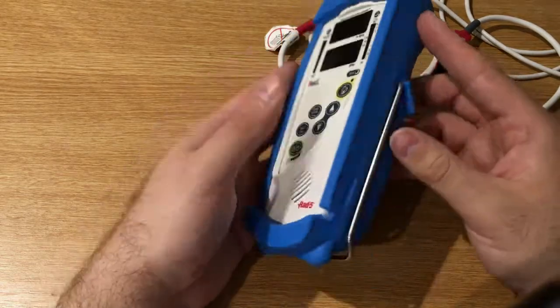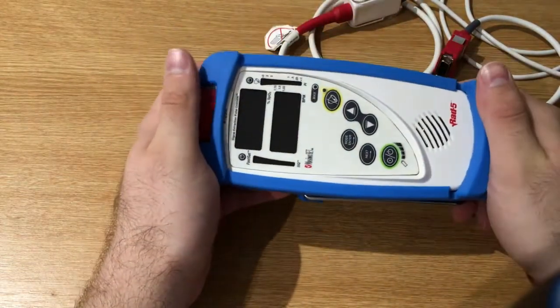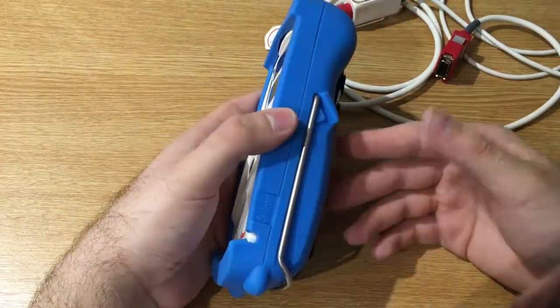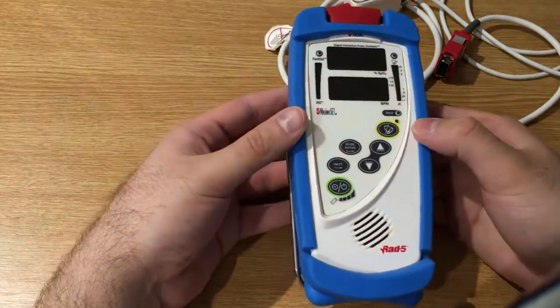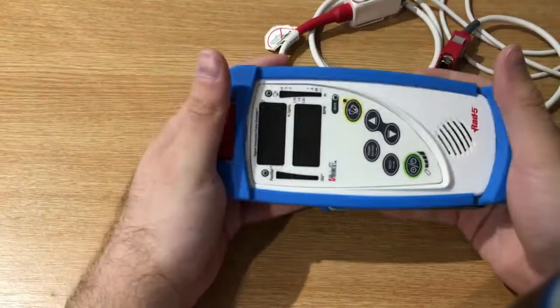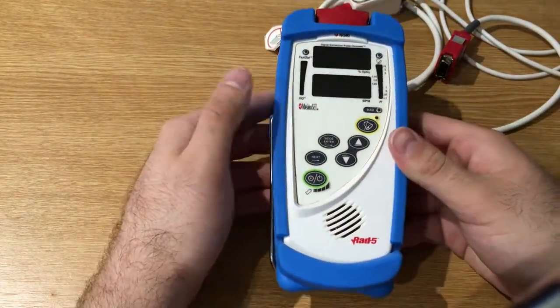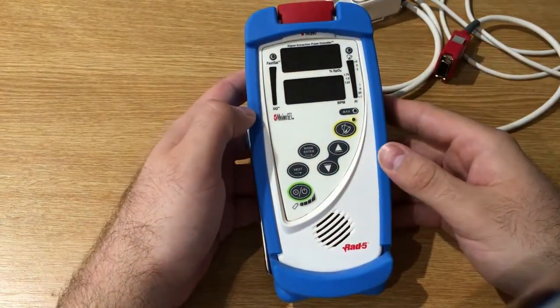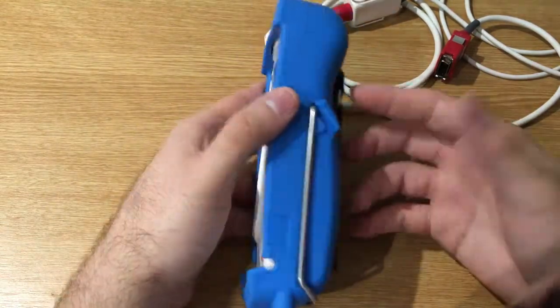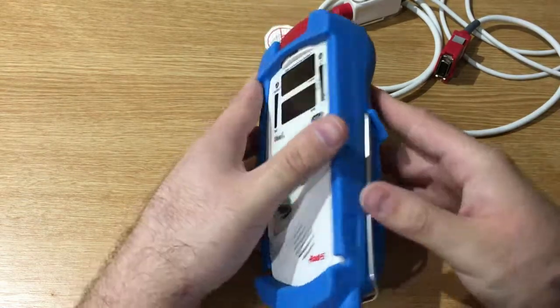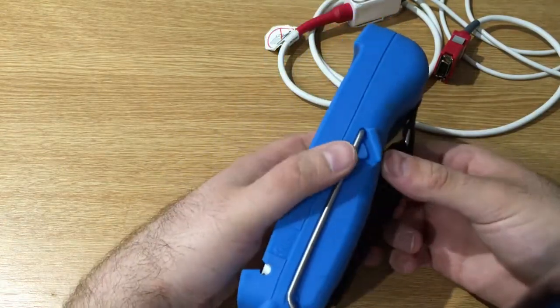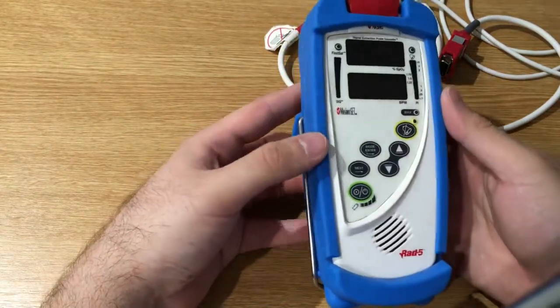I think that in a field or a normal world condition, this one is going to survive definitely better than the Radical 7. This is pretty rugged, and compared to Radical 7, I think that on this one we have pretty much everything that we need in a normal condition, and is less expensive than the Radical 7 for sure. So I think that for general purposes this is a great choice. This is a very good pulse oximeter, and it's quite good-looking as well.